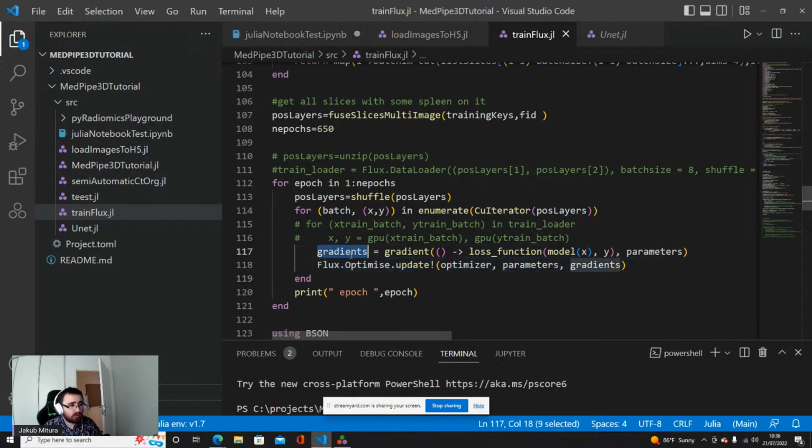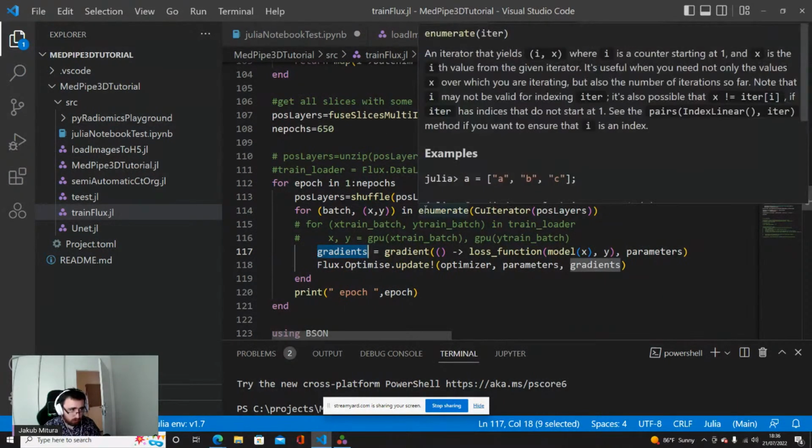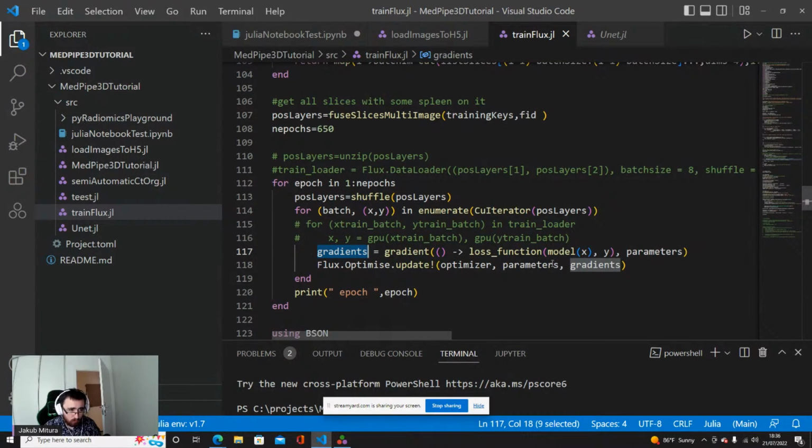So once more: we have the neural network, and the neural network has some parameters. In order for it to learn from the data, we need to pass this data, get the gradients with respect to the loss function, and then, using those gradients, we can optimize the parameters.